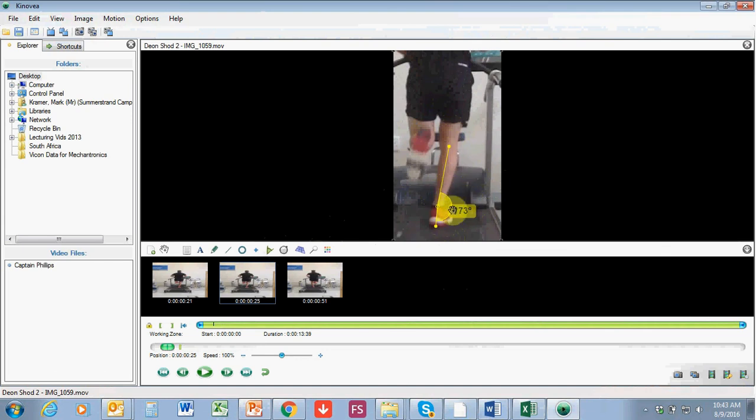So you can see here this is a slight amount of calcaneal eversion that goes beyond the normal limits, meaning that his subtalar joint is definitely pronating, and it's allowing for too much motion and mobility in his ankle joint. So what that ultimately means is that there's some aspects in terms of his posterior tibialis, or even in terms of his peroneals, that we'll start to investigate a little bit further when it comes to the actual treatment option.